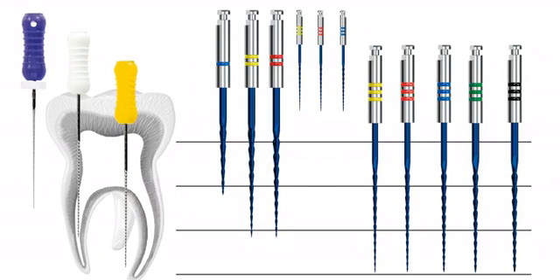You can use your laser, your PUI, or whatever agitation you want. And this is the finished tooth. The X-ray is not the best, but you can see a little sealer puff and just a single cone with bioceramic sealer and condensation technique, the continuous wave obturation technique.